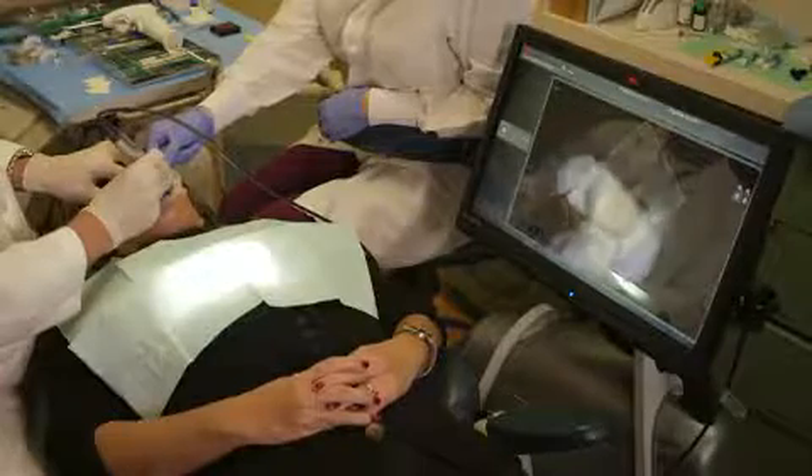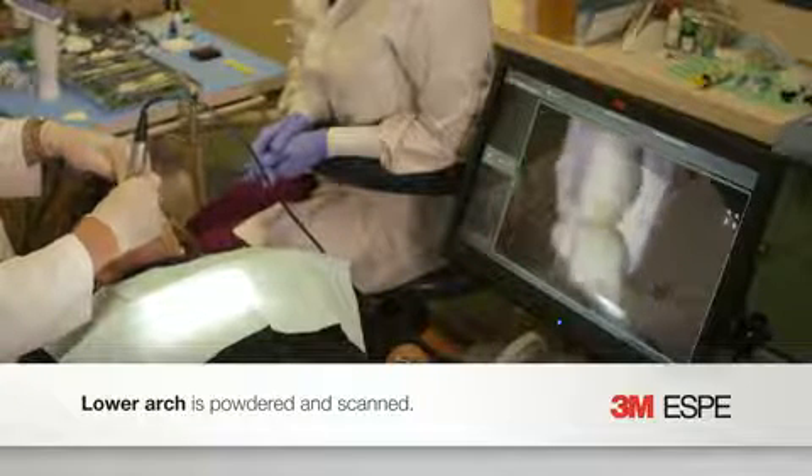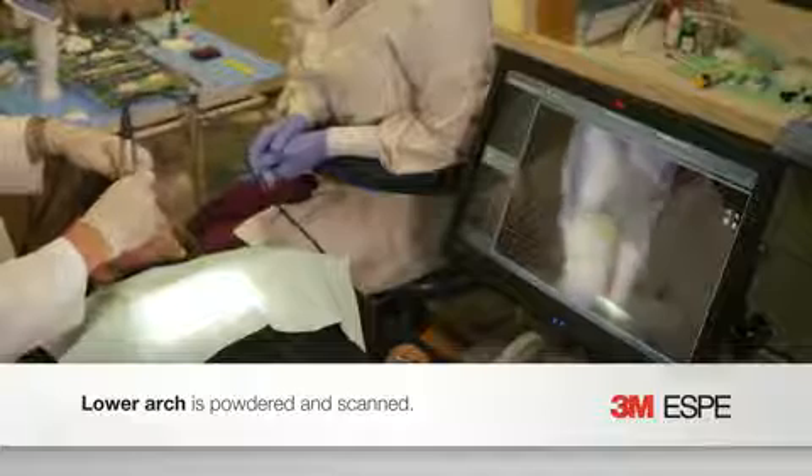It allows me to deliver restorations in a shorter amount of time. In the past, price has been a big issue with digital impressioning — most of the systems out there are $30,000 or more. With this system's price point being around $12,000, it really doesn't make sense not to do it.